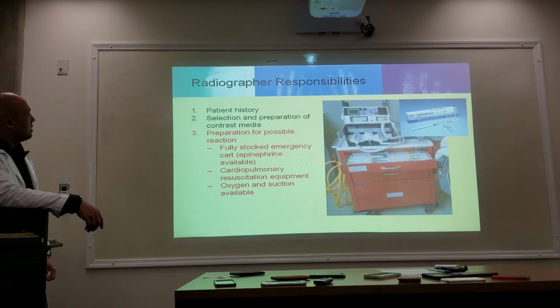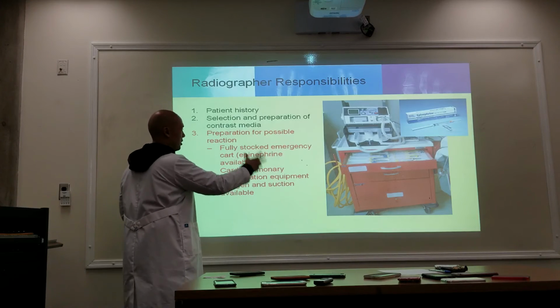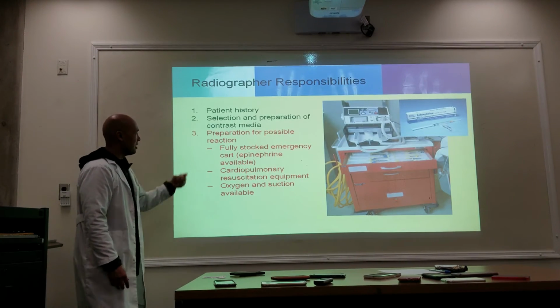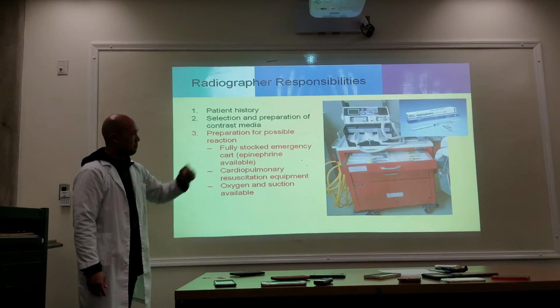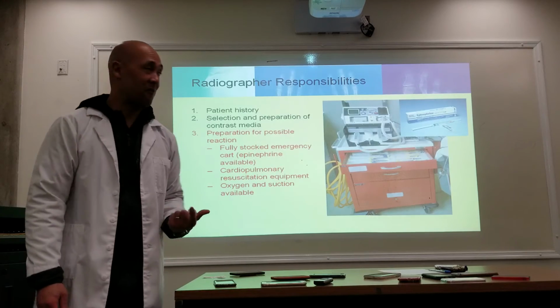Patient history, selection. Okay, so again, continue with your responsibilities: patient history, selection and preparation of contrast media, preparation for possible reaction. We're going to perform the procedure where there's a crash cart, or if not, bring the crash cart into your room, making sure that it's fully stocked, especially epinephrine, because epinephrine is the first go-to medication when somebody goes into shock.